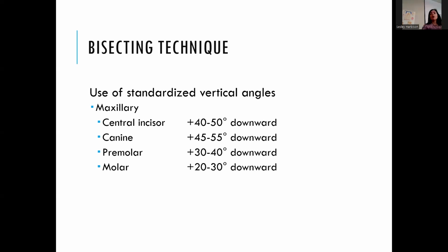You're going to bring your direction 40 to 50 degrees pointed down, and it's positive when the BID is pointing down. So put it there, then look at it and test it. You can say, oh, that does look like it would be hitting it perpendicular, or no, actually, I have to tilt it slightly one way or the other.